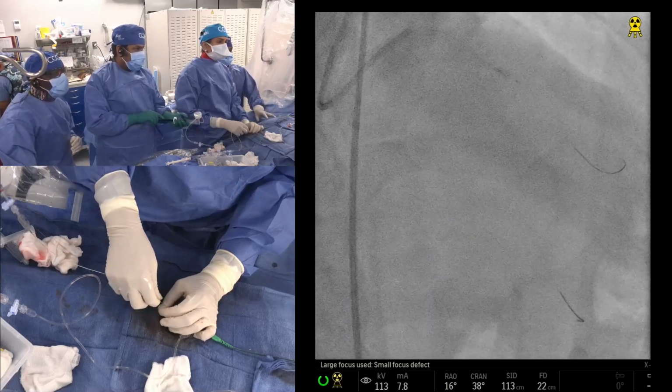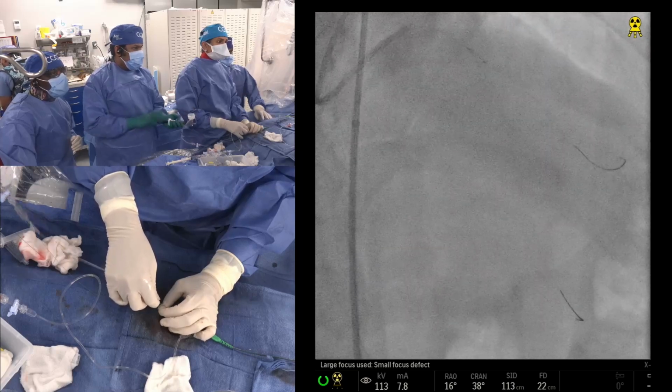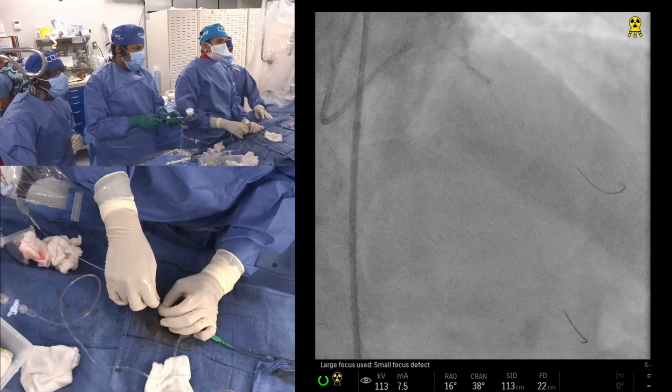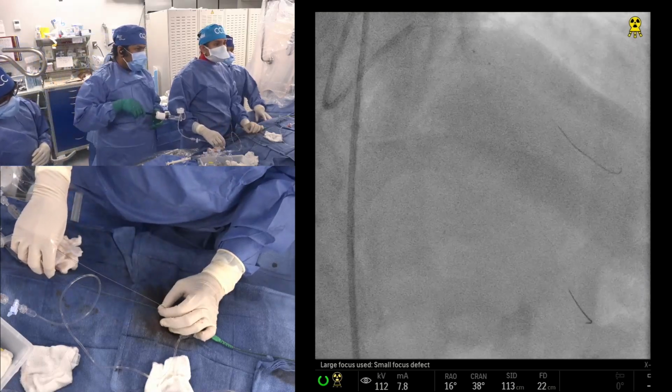Okay. And this is a fascinating, I think this is a, Go up here. Yeah. do not know the name of the doctor, Down. but the web name is India Chic.